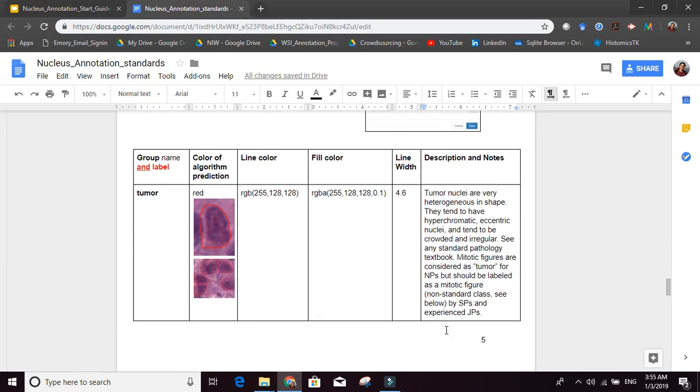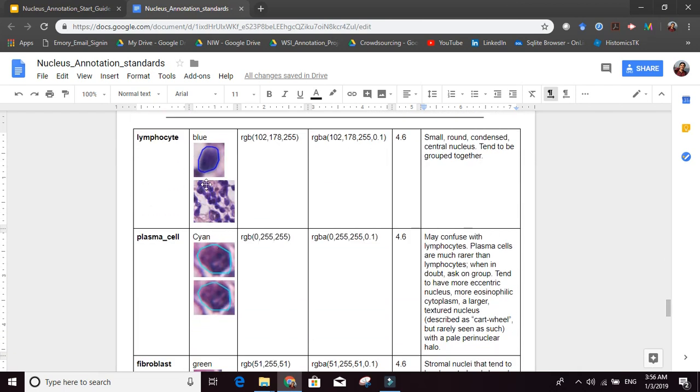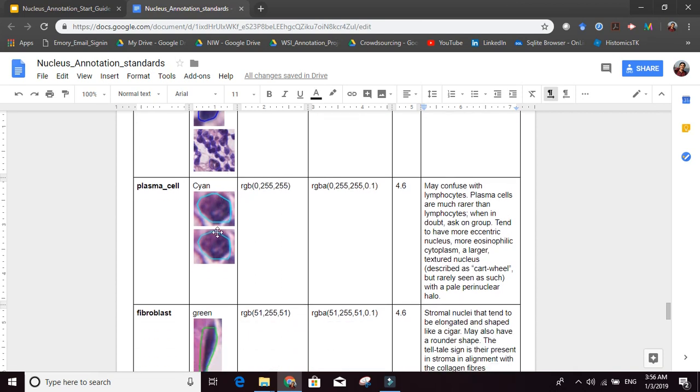Now, like I said, the computer will have its own predictions that you want to correct. So this is what the computer prediction looks like. What the computer thinks is a tumor nucleus is going to get a red boundary. What it thinks is a lymphocyte is going to get a blue boundary. What it thinks is a plasma cell is kind of cyan.